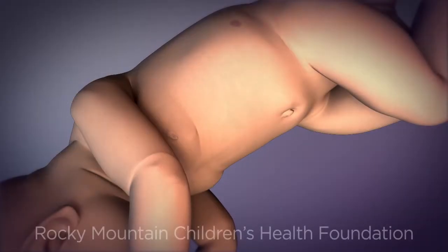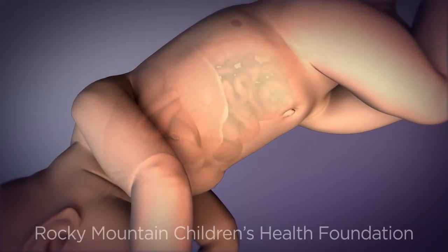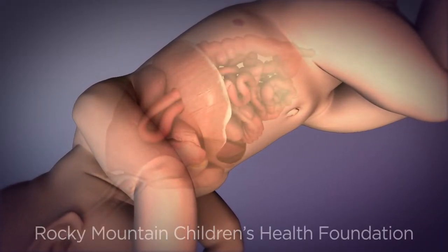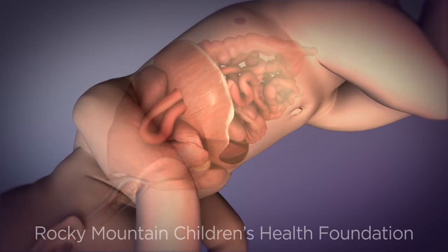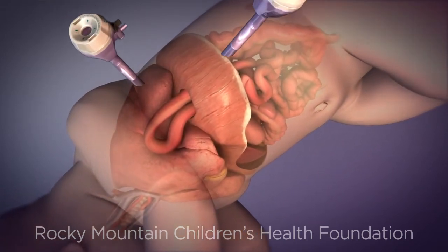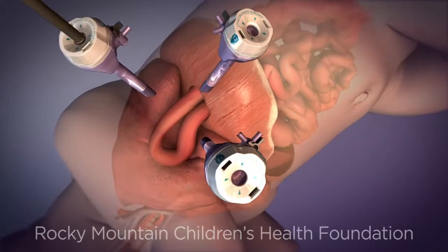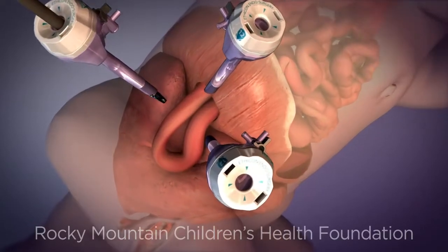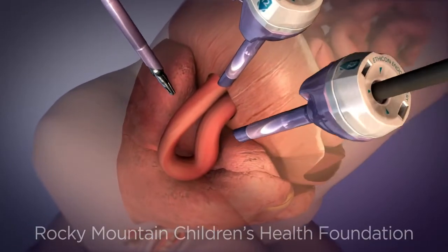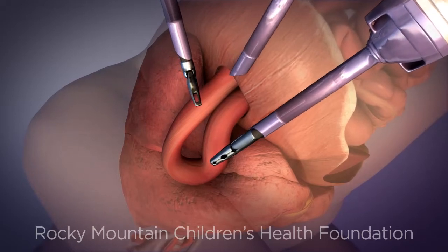By placing the infant on his side, it's possible to gain access to the hernia located in the diaphragm. The surgeon creates three small openings, called ports, to allow a tiny camera and instruments to enter the chest. The camera offers a magnified view of the area.